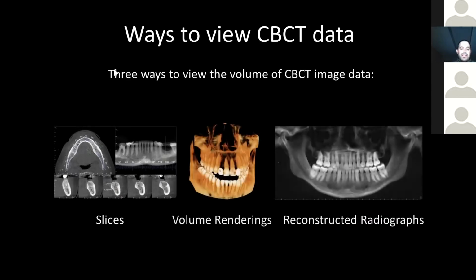When we actually get the data out, it looks like this. Okay, so this is our volume rendering here. And each little component of this is called a voxel. If you're familiar with a pixel, on your digital photograph or your computer screen or phone screen, picture really stands for picture element in a 2D digital image. Well, if we talk about a 3D data set, each single element of that is, excuse me here, a voxel, a volume element.